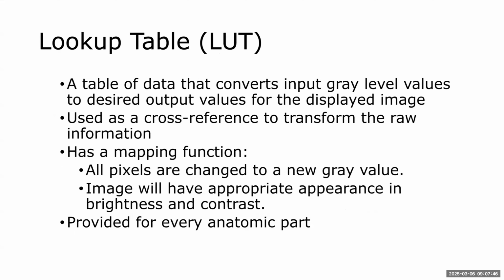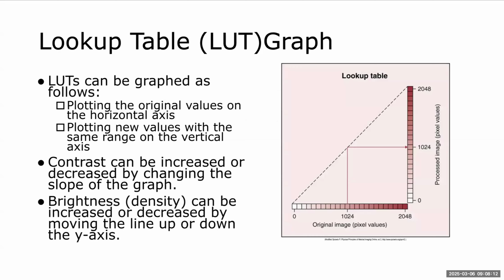If your data set doesn't match that lookup table, then it's going to change those brightness levels, and that's called automatic rescaling, so that it displays the same. In other words, it's going to try to fix the brightness so that the images look the same whether you use the right amount of exposure or not.